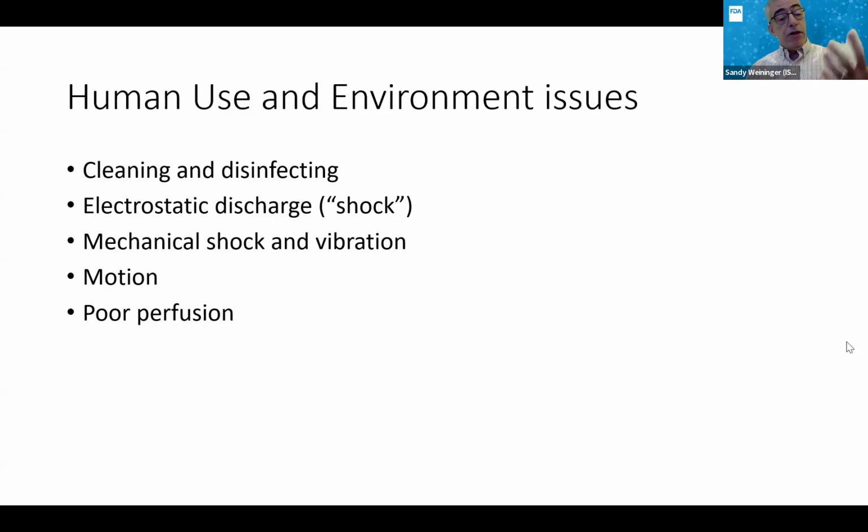But I'll give you an example of a real world challenge. We're not going to put a desaturation study in the back of an ambulance or on a shaker table or vibrate it, because you're not going to vibrate the voluntary participant and you're not going to get any good measurements, right? And the same is true for motion and some low perfusion studies. Okay, next slide, please.